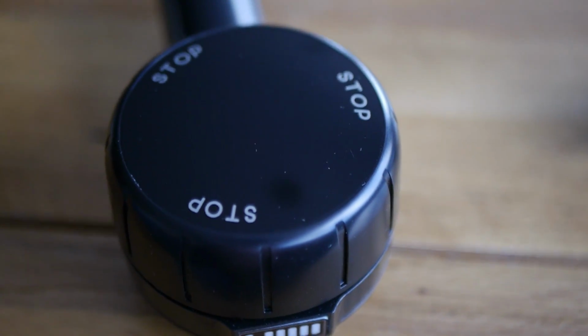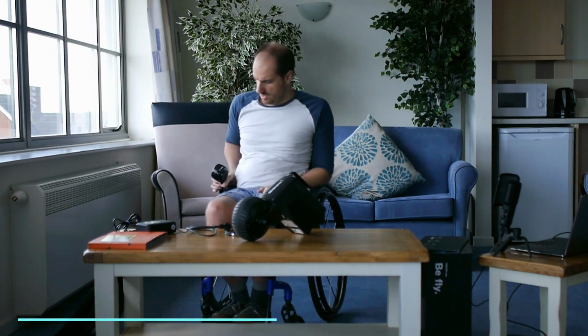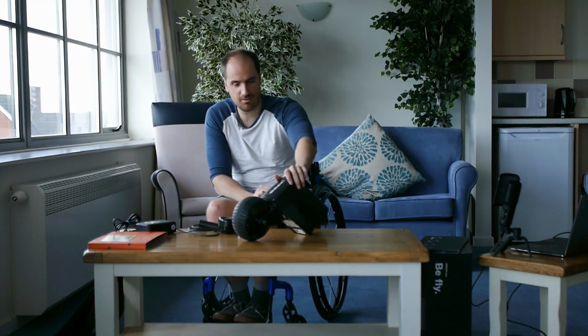So this is the control unit. This attaches to your wheelchair here, and this is how we get it starting and stopping. I don't think you need to, it's just starting it and then you let go of it. You don't have to use it all the time, but we'll go through that in a minute. And then onto the actual unit itself.